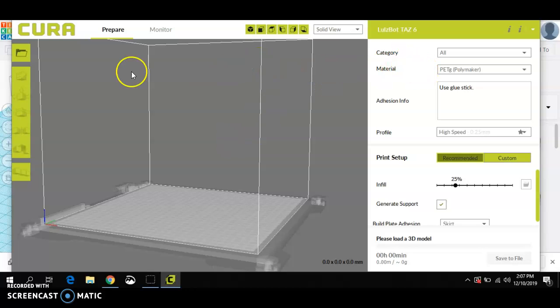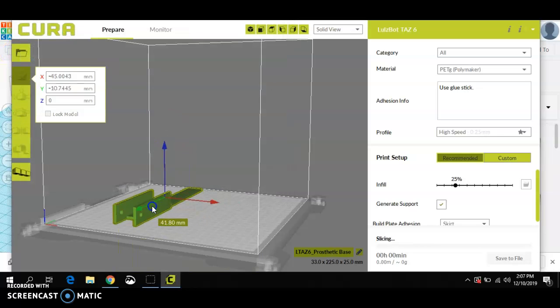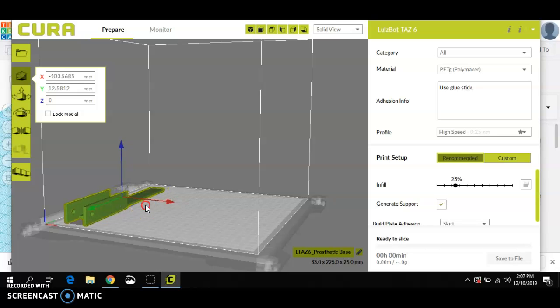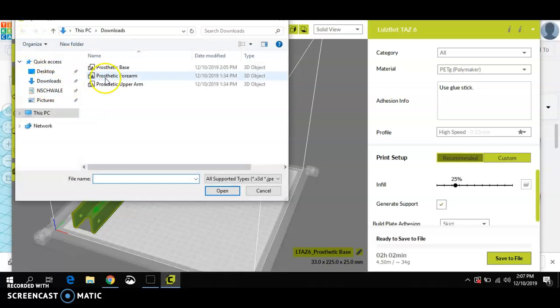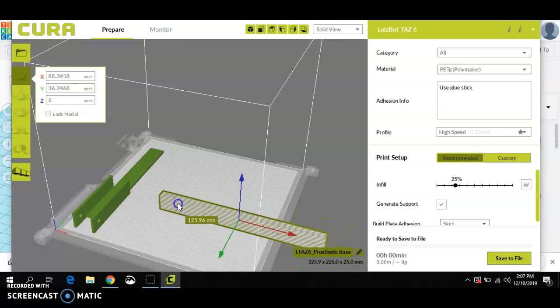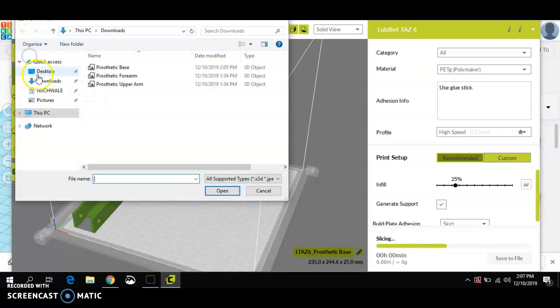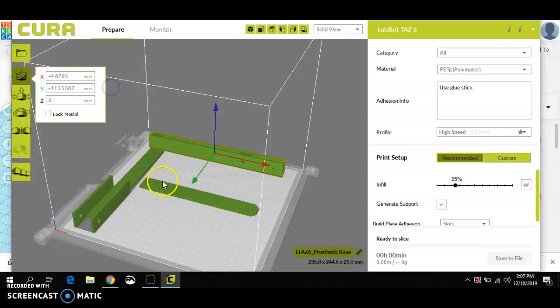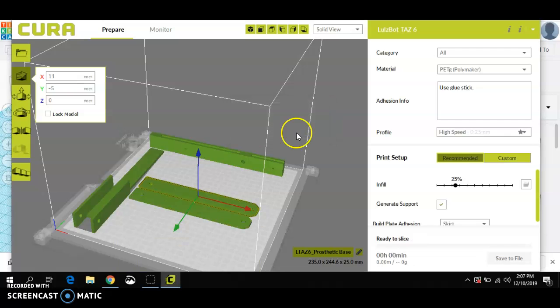So the way that we get our file in here is to go to that envelope, double click on the base. You see I've already downloaded the other files from Tinkercad also. So I'm just going to grab the forearm. If it's not all the way on the bed, it will show up like so, but look like a solid object when it's on the print bed. Okay, the upper arm, we'll need two of the upper arm. So we're going to go to multiply objects, make one copy.